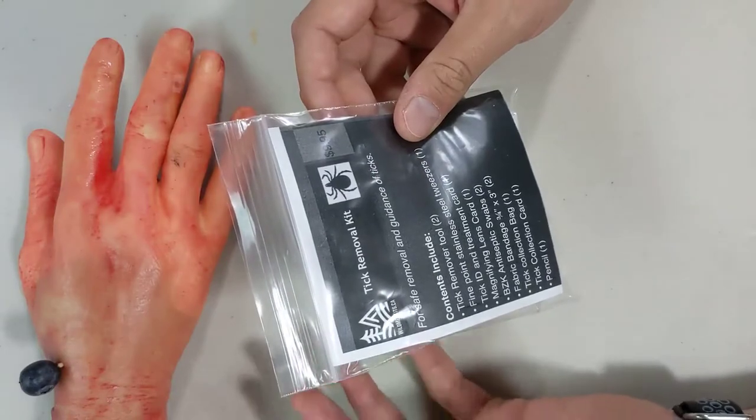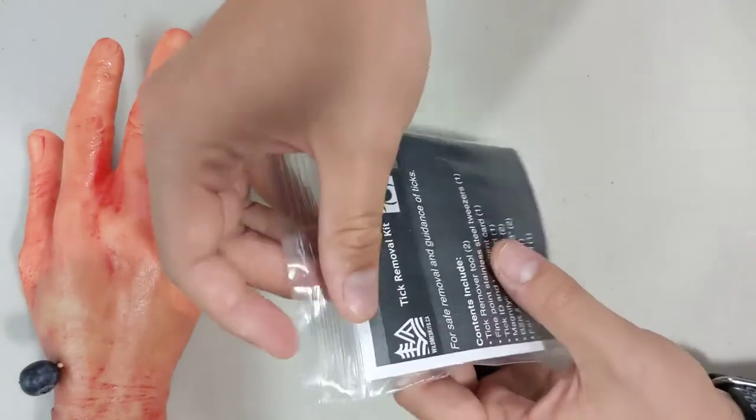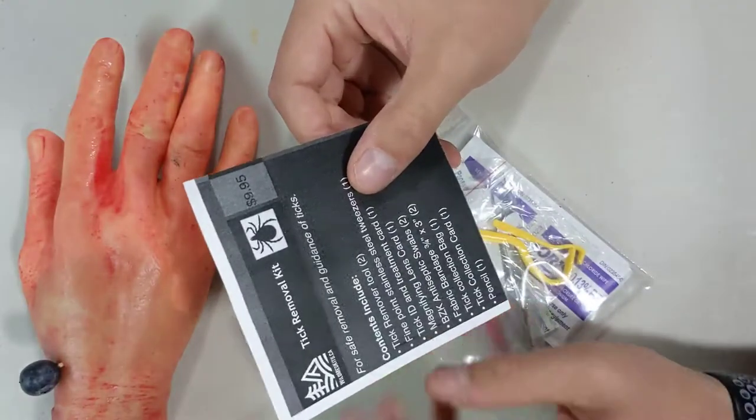The kit is nice and small — it will fit in any first aid kit or to take on a day trip, easy to throw in a backpack. It's sealed in a waterproof poly bag, and there's a contents list right here that goes over everything that's in the kit.